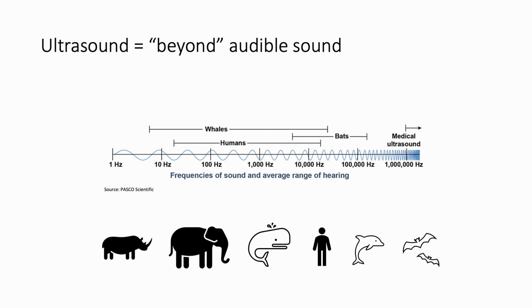And just like those light rays have different wavelengths and different energies associated with them, the same thing can happen with ultrasound. And the higher our frequency goes up, the more energy will be imparted into the body or the tissue that we're ultrasounding. On average, medical ultrasound relies on frequencies of sound occurring between 1 and 15 megahertz, which is the same thing as 1 to 15 million hertz, or cycles per second.